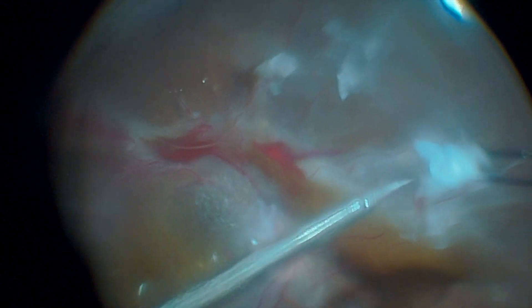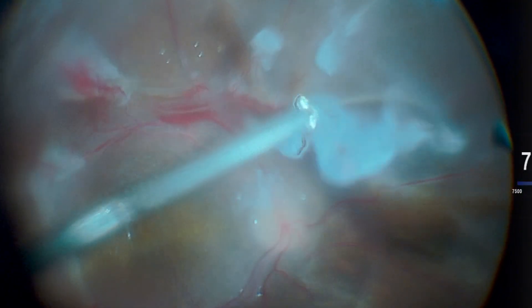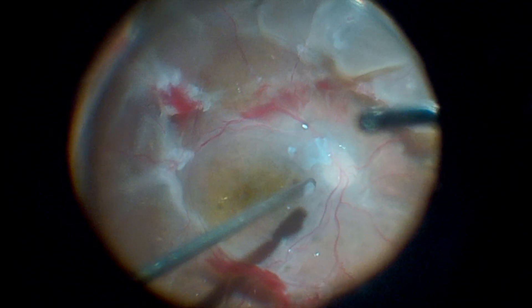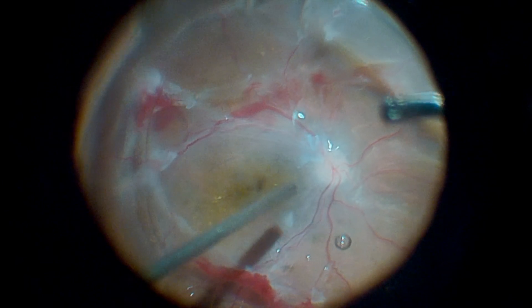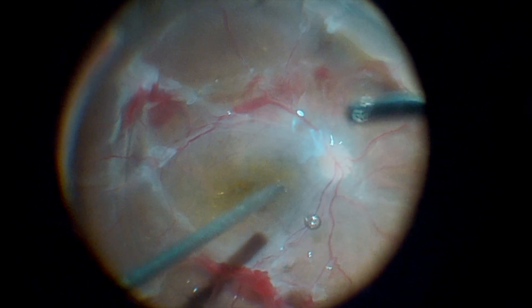It is important to address the traction bridges from the preretinal membranes to the retina so that they can be removed in one piece with minimal traction on the retinal tissue. At this point, perfluorocarbon is added.